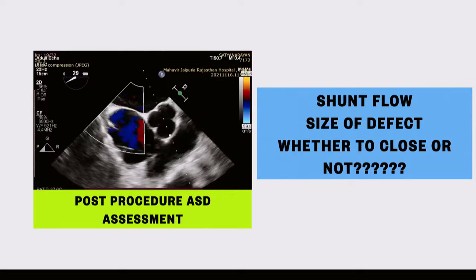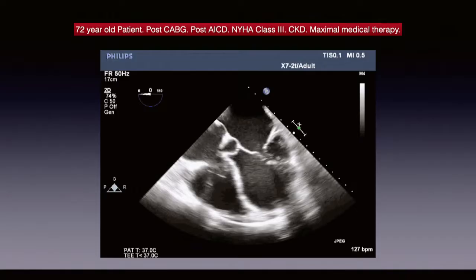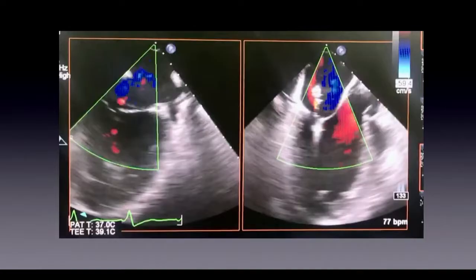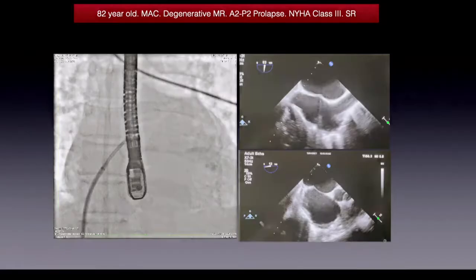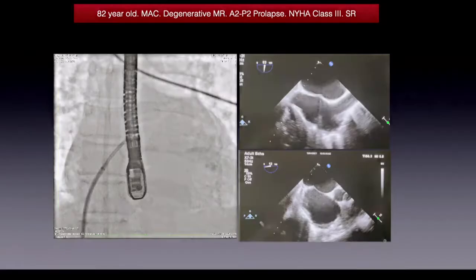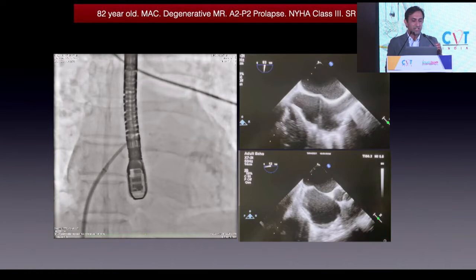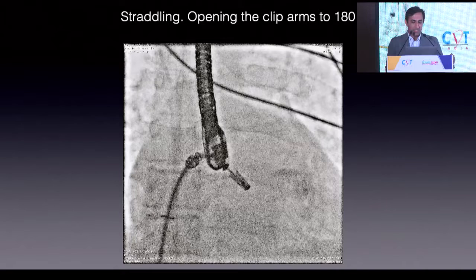A 3D TEE shows two clips implanted with residual minimal mitral regurgitation. An example of post-CABG functional MR: one clip was implanted, showing double-orifice mitral valve with no mitral regurgitation. For degenerative MR, surgery is better, but here is an 82-year-old with mitral annular calcification and A2-P2 prolapse: standard septal puncture and 3D TEE, with one clip implanted.